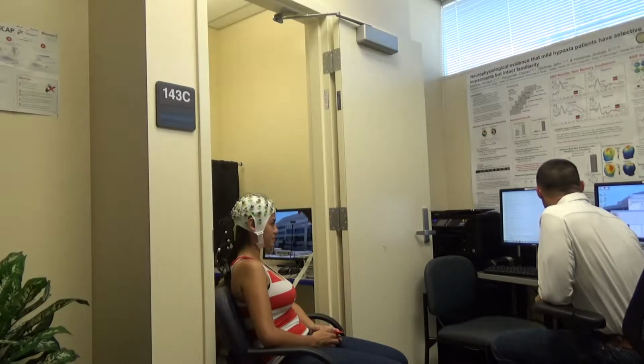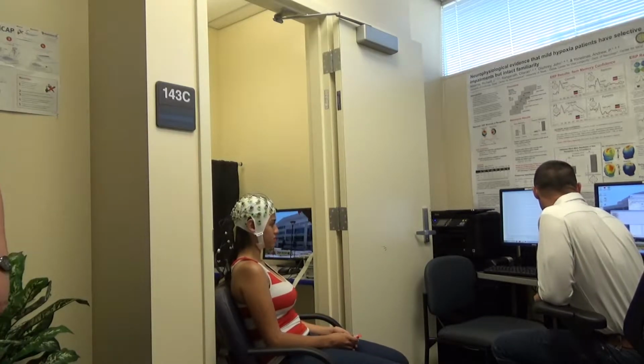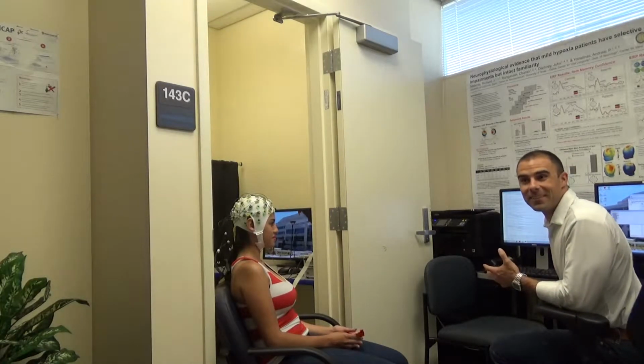Okay. And what we can do, do you guys remember why does it look so flat? Because you're zoomed out. Too far away. Yeah, we zoomed out a lot, right? So we can zoom in a lot more. You can see that things look a little bit more brainwavy, right?